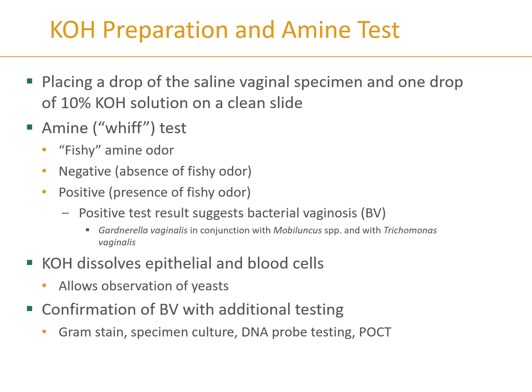And then if you're doing the amine test, that's referred to as a whiff test, and what you're doing is you'll waft over top of that sample to spread any odor, or fishy odor, of those amines as it reacts to that KOH. You would smell for the presence of those amines or that fishy odor. If it is positive, if you do smell that fishy odor, it would suggest bacterial vaginosis. The KOH will dissolve the epithelial cells and the red blood cells, but it would leave the yeast cells.